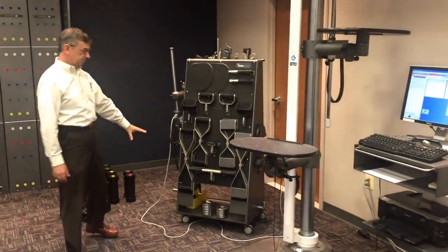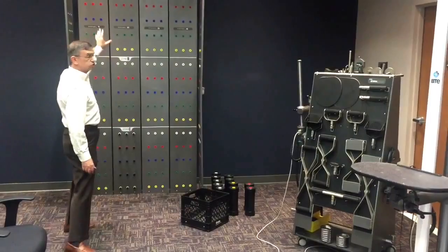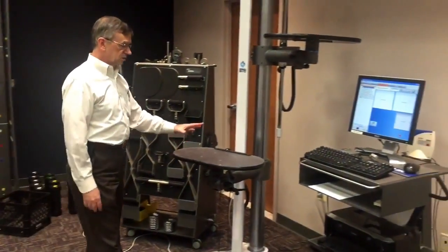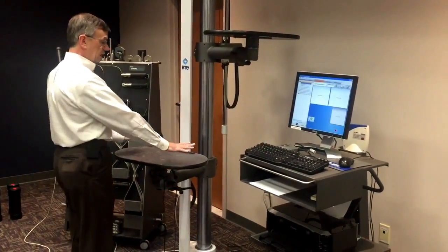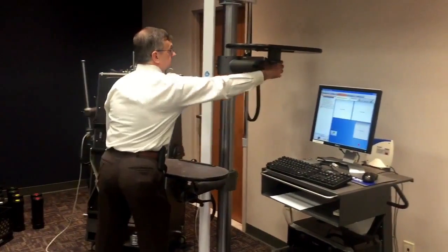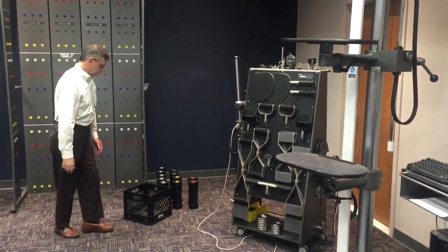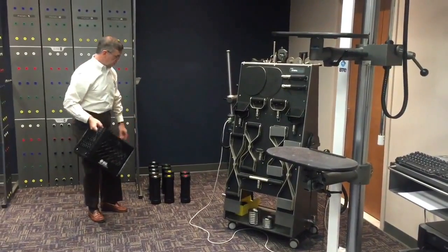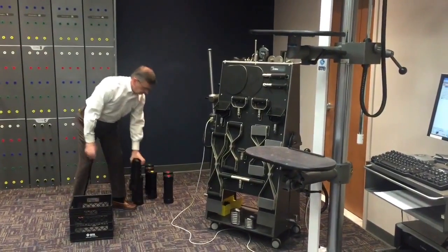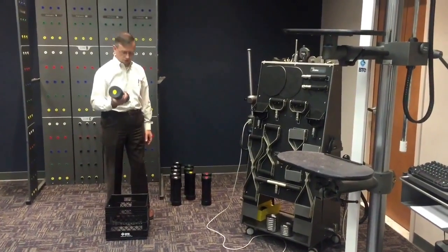These are the various attachments that can be used, and over here to my left we've got the functional range of motion board. So when the test is being conducted, it's simple to go from one setup to the next. Right now we've got a shelf on here that we can use for lifting. We use a specially weighted crate and a variety of weights that are color coded, so that when a clinician selects a weight, the color code will remind the clinician what the weight is, but the person being tested has no idea.